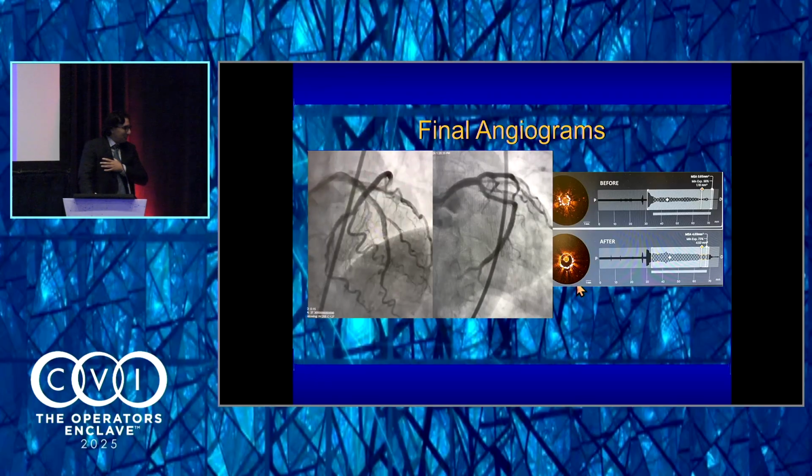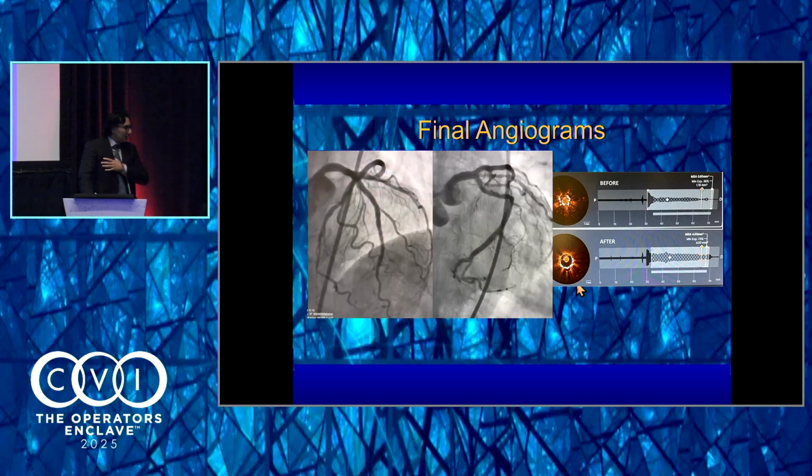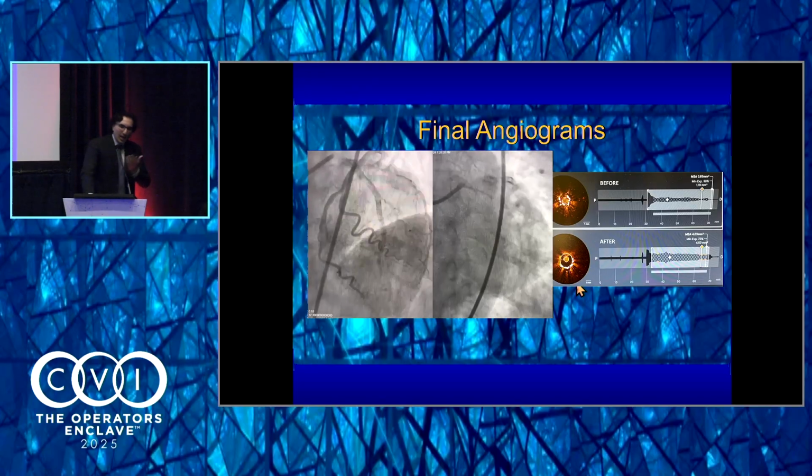Looking back on it now, as your experience has increased, would you go with a bigger balloon or higher pressure, or do you feel like this is a fully adequate result? I think this is pretty good.